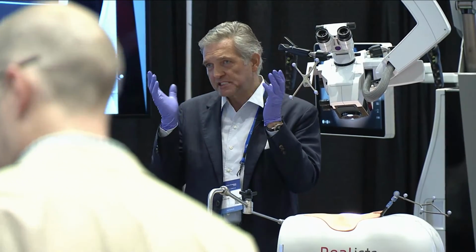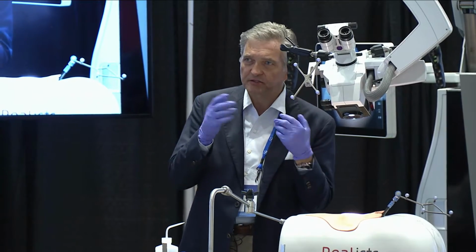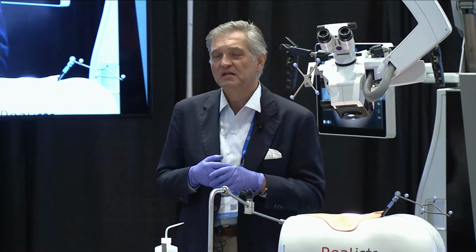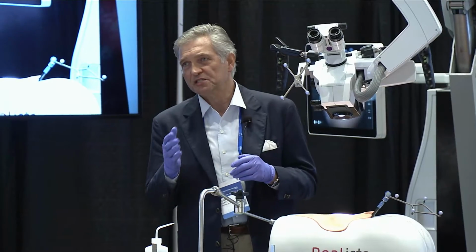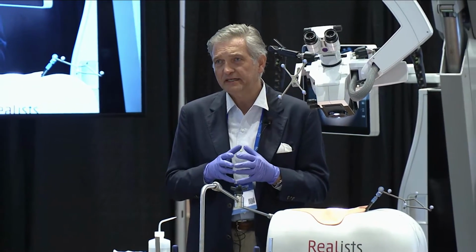Now you could do the same thing with goggles, but if you use the goggles, you lose the microsurgical ability. So the microscope allows you really to combine both.